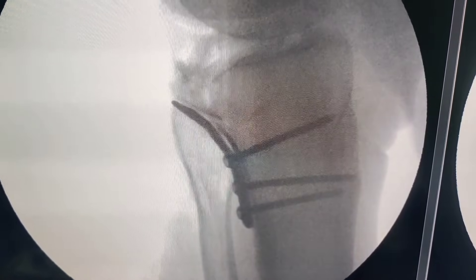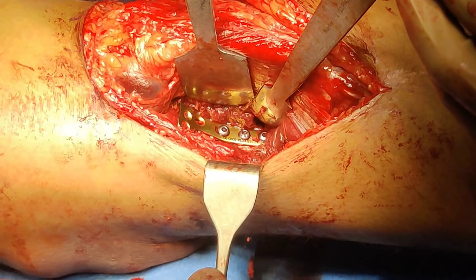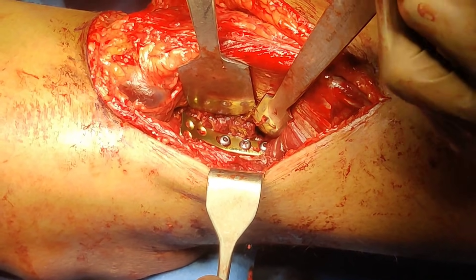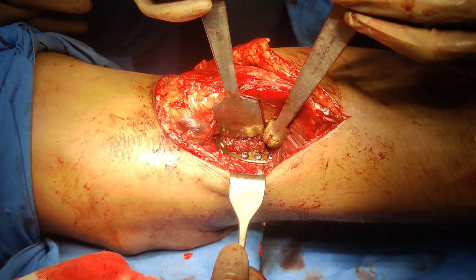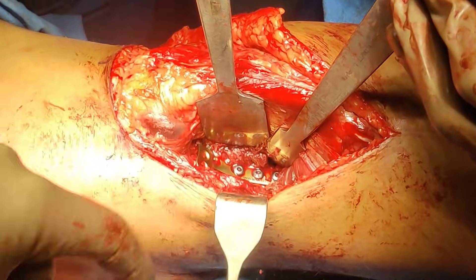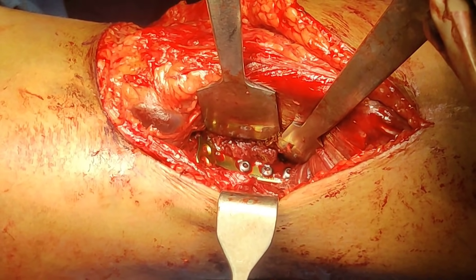Now I'm going to show you how it looks clinically. This is our final fixation done and it looks pretty good. You can see there is no movement at the fracture site — it is nicely compressing. There is no point putting screws apically because what we want is buttress, and this is doing a good job.